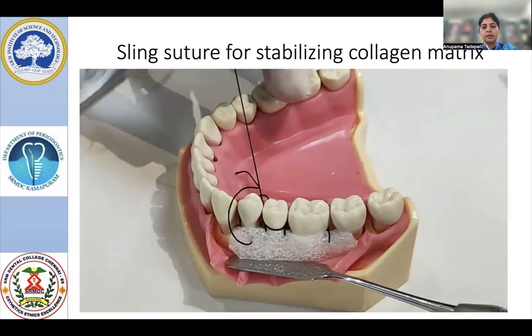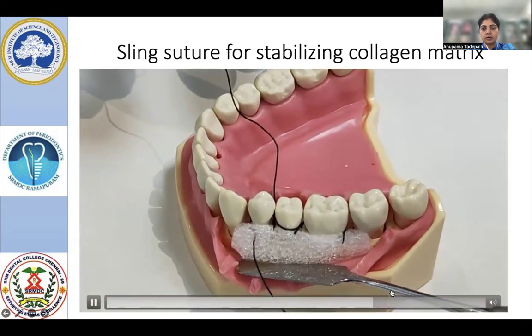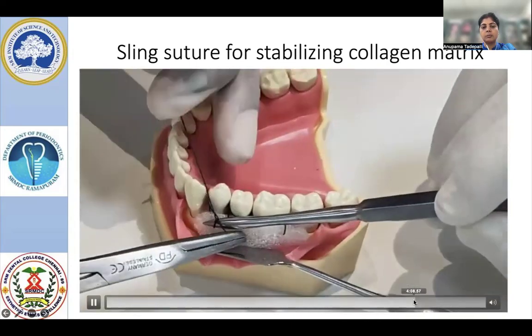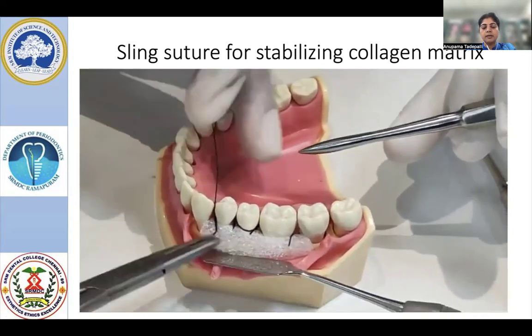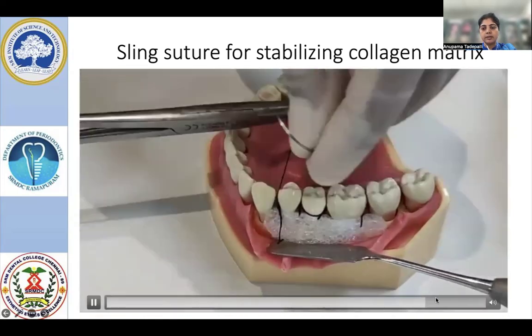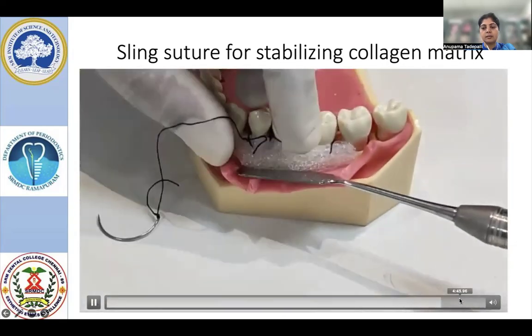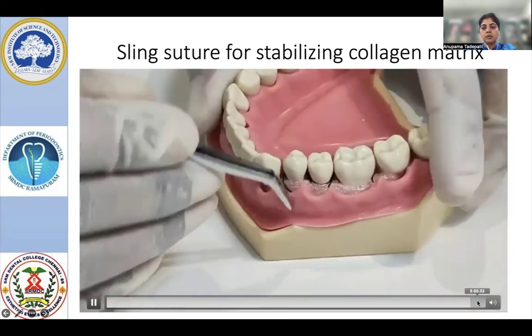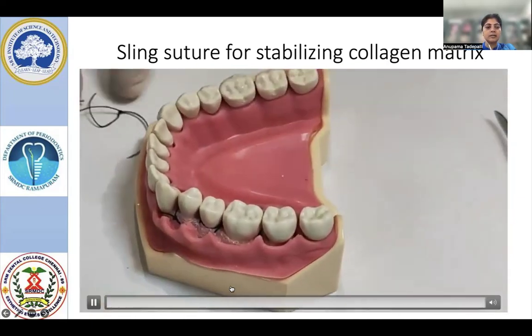Interproximally, we are coming back and emerging onto the first interproximal area, where you will be placing the knot. Here also, preferably use a resorbable suture material. Once you finish knot placement, the same procedure applies — check the superficial flap to see whether it completely covers the biomaterial. This is how we finish suturing of collagen matrix using continuous sling.